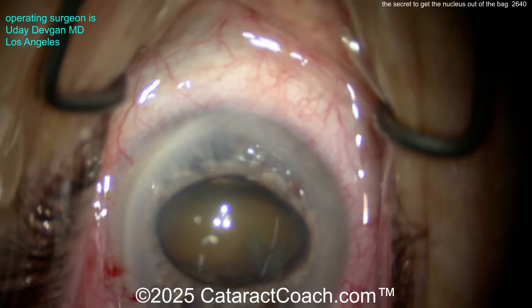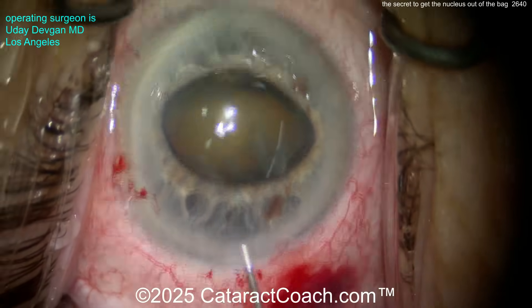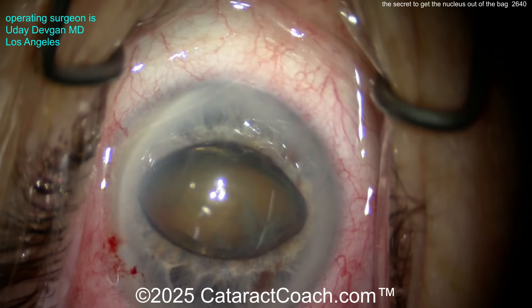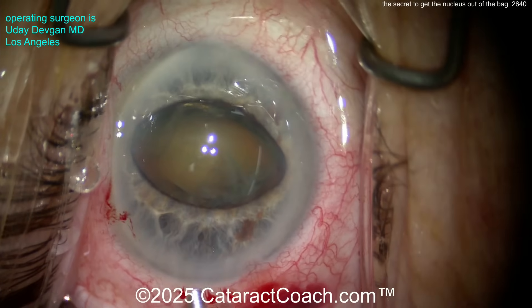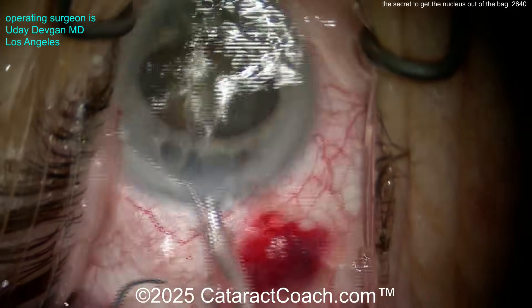So now where's the nucleus? It's hidden half in the bag, half through the pupil. The iris is actually doing us a favor and holding the nucleus for us. There's a floppy iris — the patient takes Tamsulosin. Now you can see extra viscoelastic to protect the cornea, but also keep the iris at bay. And now with the nucleus held for us and tilted on its side, it's super easy to chop it.